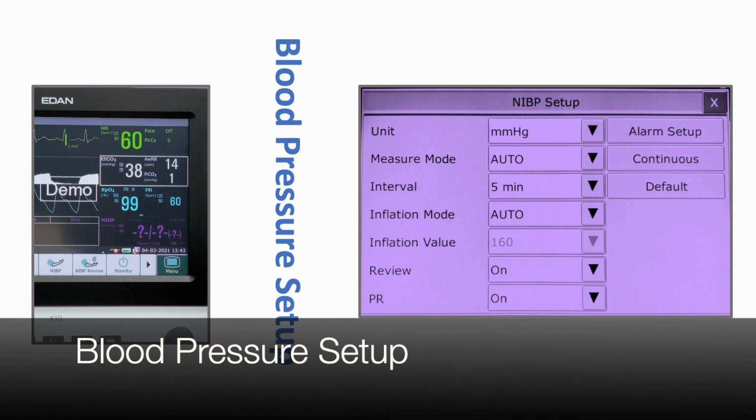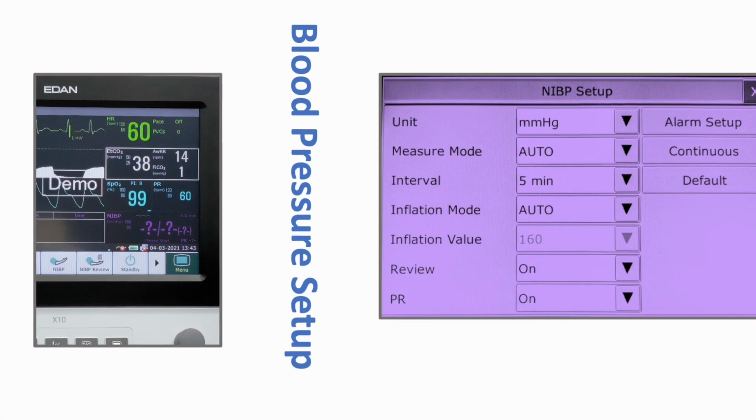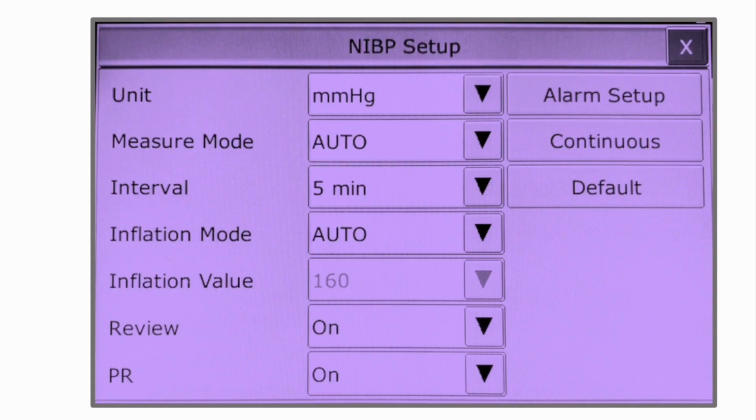Blood pressure setup. Enter the blood pressure setup menu by touching the blood pressure parameter area on the monitor screen. Recommended settings are shown here. Measure mode should be auto. Interval is typically set to 5 minutes. The interval setting will determine how often a blood pressure will be taken. Additionally, it's important that the inflation mode be set to auto and unit is mmHg in order to obtain an accurate blood pressure reading.